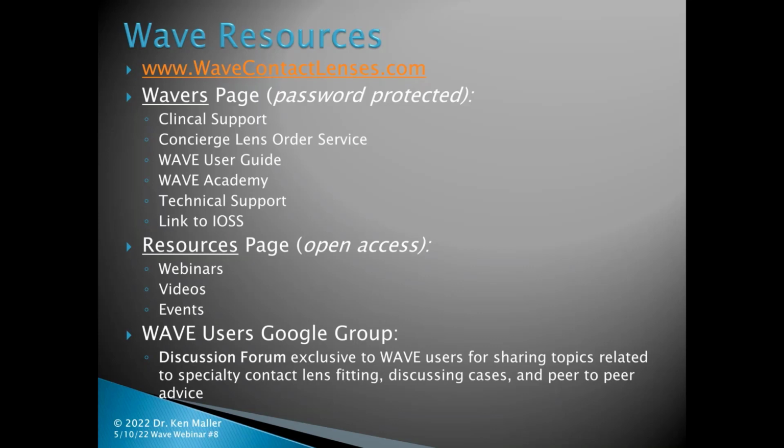If you see tear frothing, that's going to be a problem. It doesn't matter what lens you put on there, that's going to be a problem. If you see very, very quick breakup times, that's going to be a problem. So those are the types of things that you really need to be on the lookout for. Tear breakup time looks fairly normal. The meibomian glands don't look that terrible. The lid margin is not that awful. It's not like that eye where you can see the blepharitis from across the room when the patient walks in. Those are the types of things that need to give you pause. And like I said, step one is really to try and resolve some of those things before you even think about lens fitting, regardless of the type of lens.